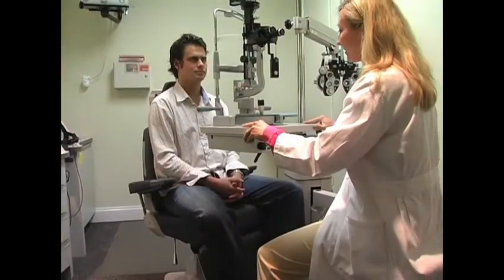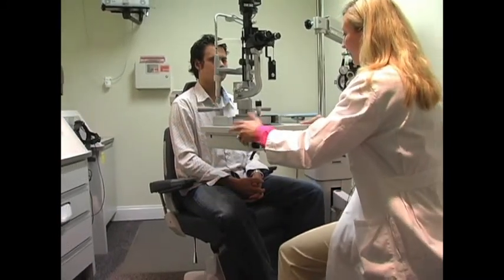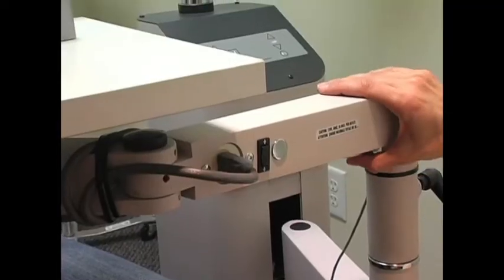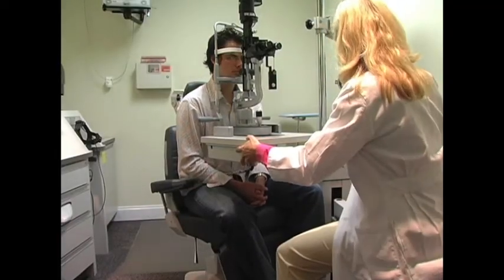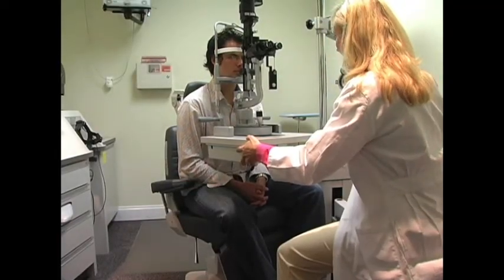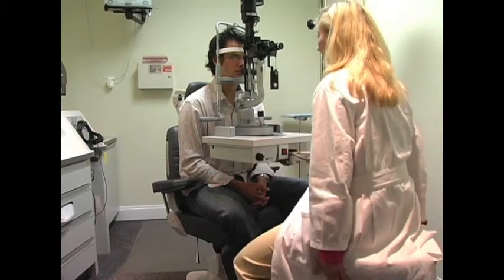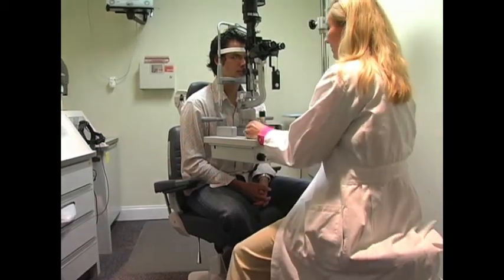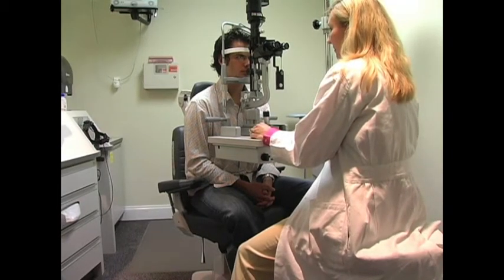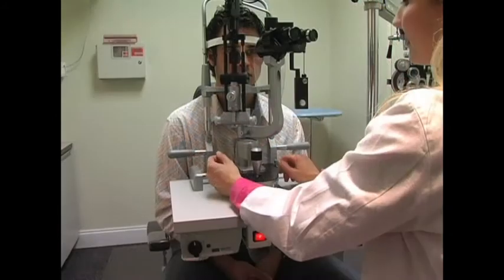Familiarize yourself with the table controls as these differ widely among manufacturers. The table is moved up or down while depressing this lever. The table should be at a height that allows the patient to be seated comfortably while positioned at the slit lamp. The examiner should adjust their own chair to be seated comfortably as well. Remember, the patient should not be seated on a chair with non-locking wheels.